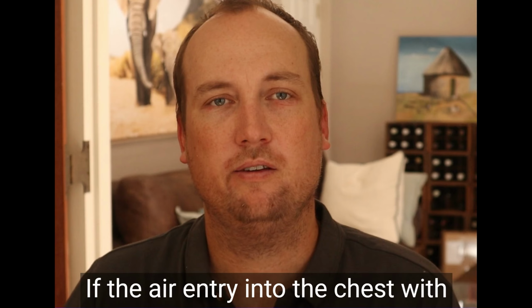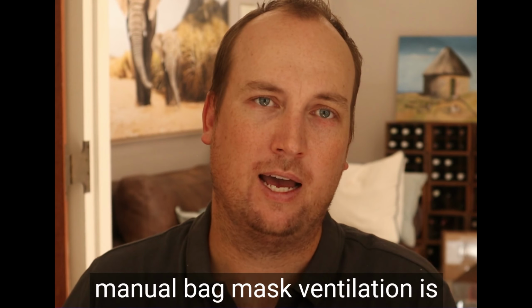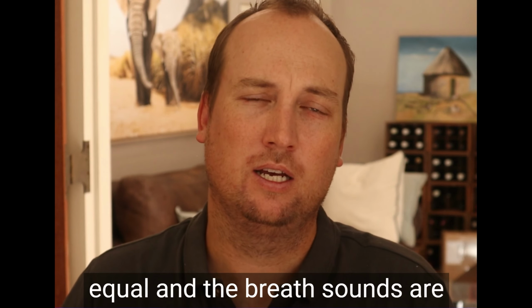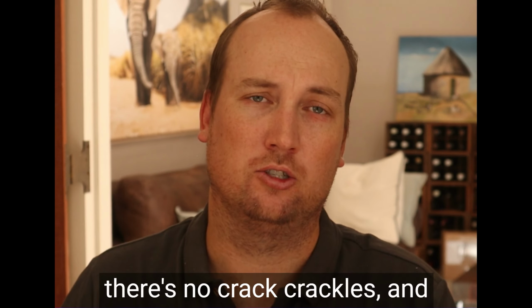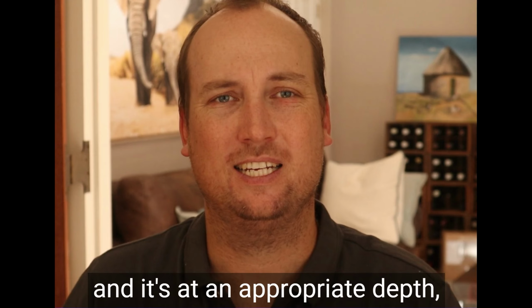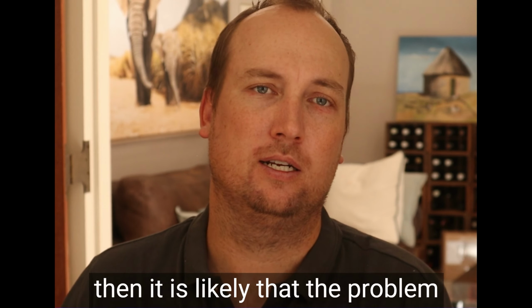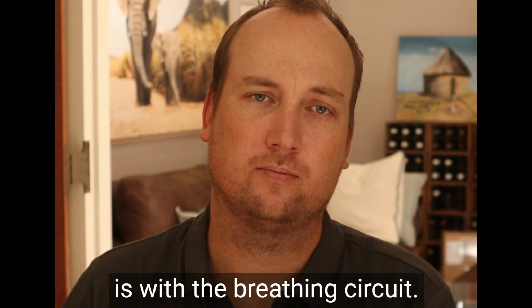If the air entry into the chest with manual bag mask ventilation is equal and the breath sounds are clear and there's no wheeze and there's no crackles and the endotracheal tube is patent and it's at an appropriate depth, then it is likely that the problem is with the breathing circuit.